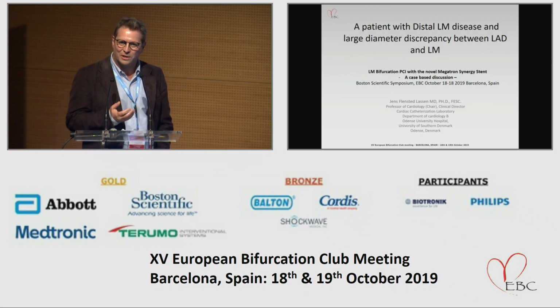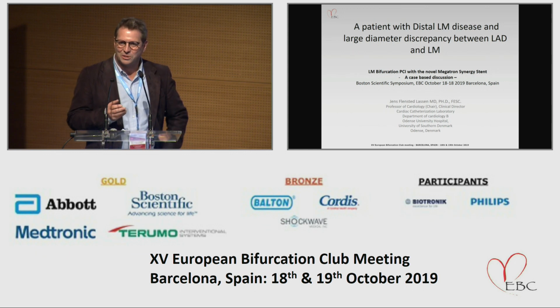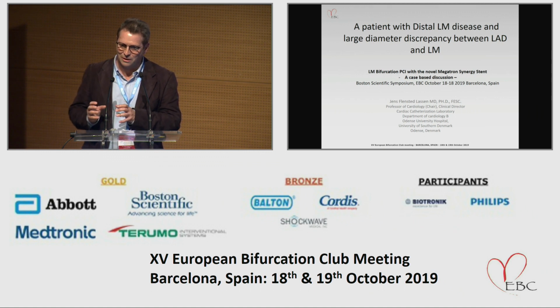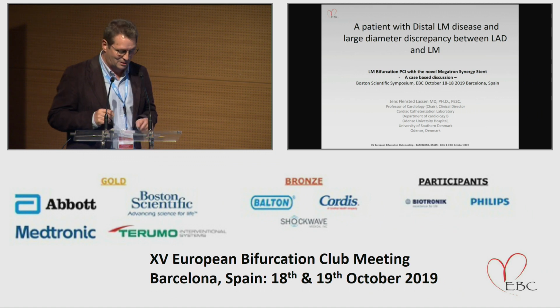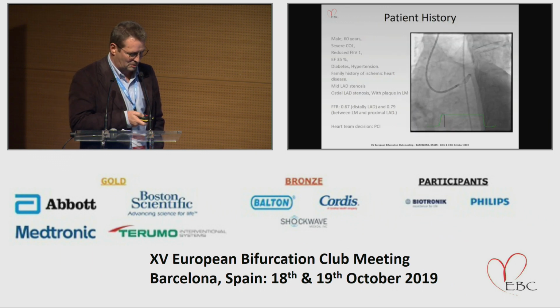I believe after my presentation we can continue the discussion of the mechanical properties, and I know that there are some of the engineers present in the session, and I guess they would like to answer some of the questions raised. What actually is important is what Thierry started out by telling. What do we really need for left main? We need a stent which has a capability of being large in one end and being not so large in the other end. And we don't have that until now. So let's see what happens when we use these in clinical practice.